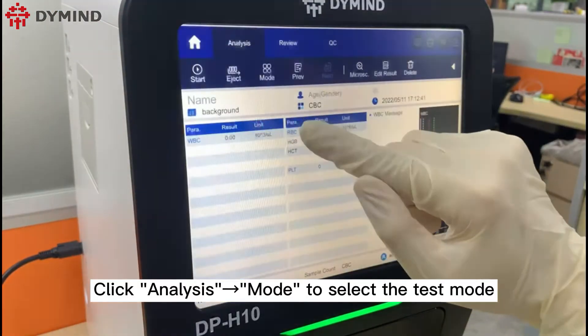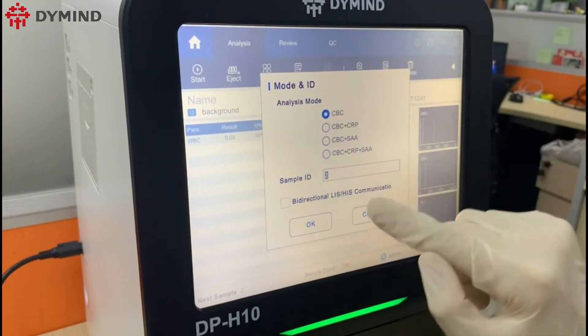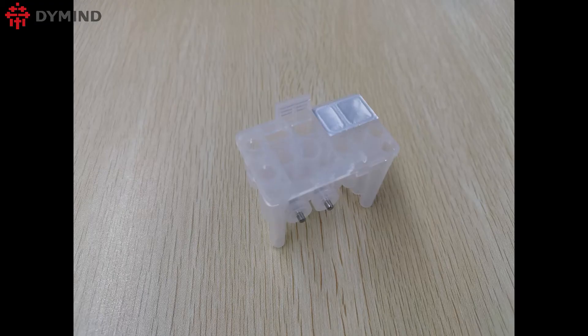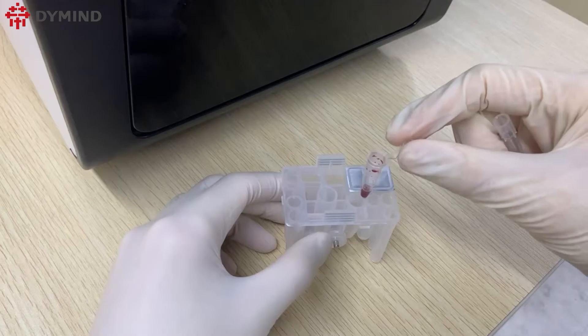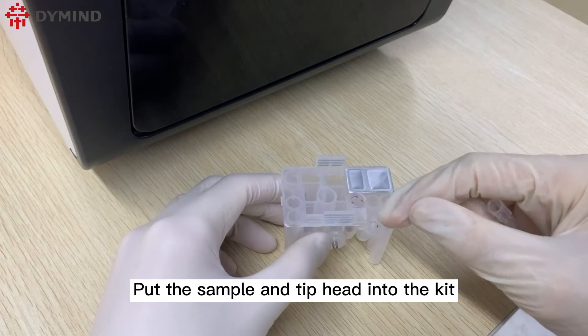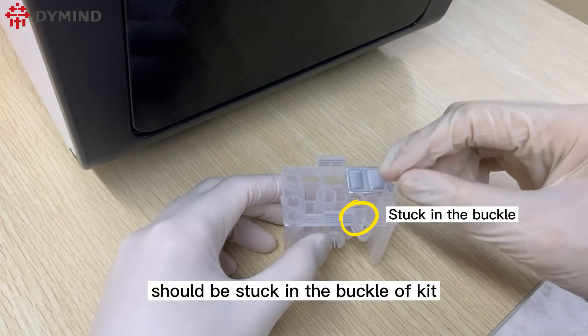Click analysis mode to select the test mode. Please check the kit to ensure it has not been damaged, then put the sample and tip head into the kit. The cover of the tube should be stuck in the buckle of the kit.